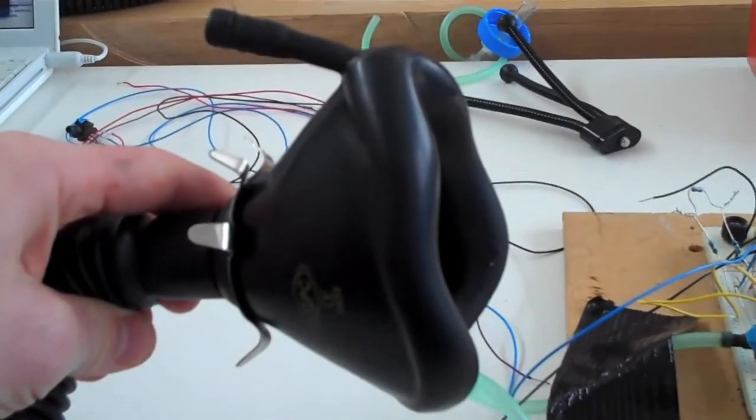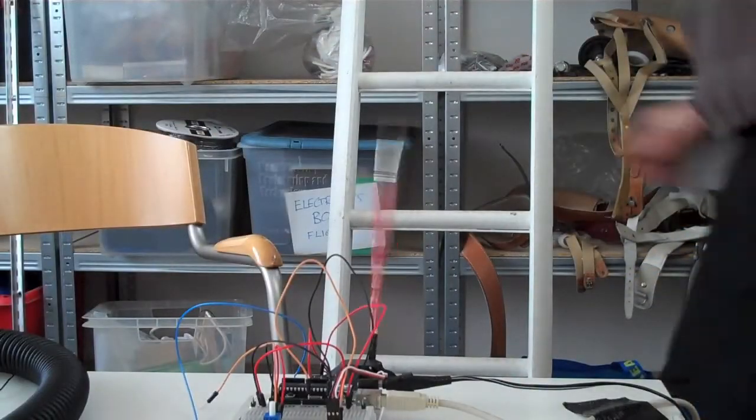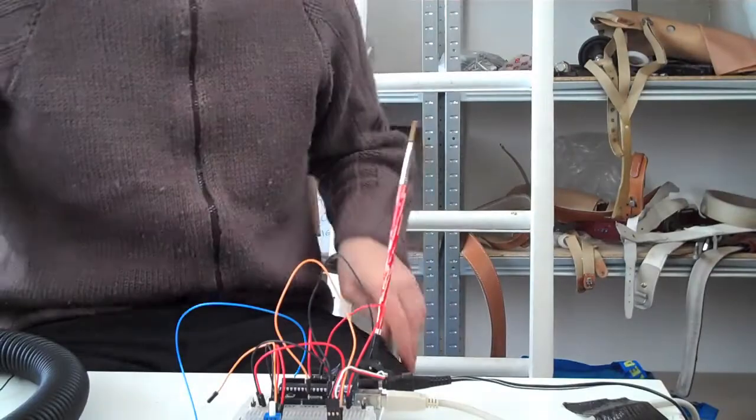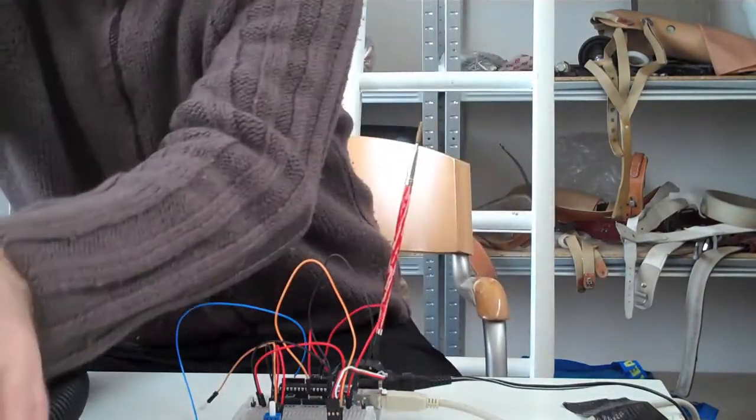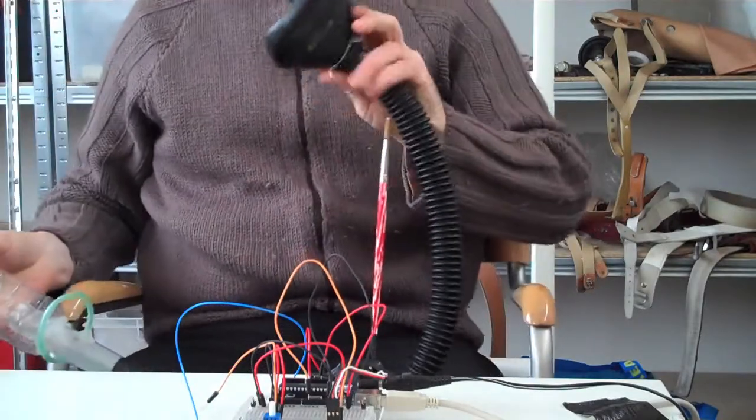This is the anaesthetist mask that I'm going to be breathing into. So I'm going to demonstrate a series of experiments now. Firstly, I'm just going to breathe normally.